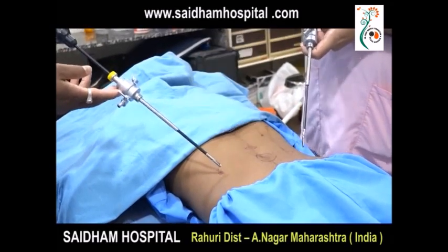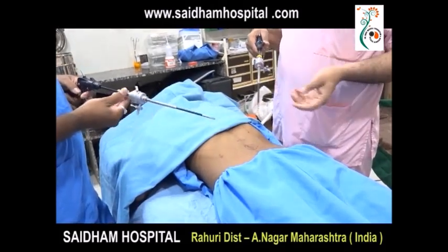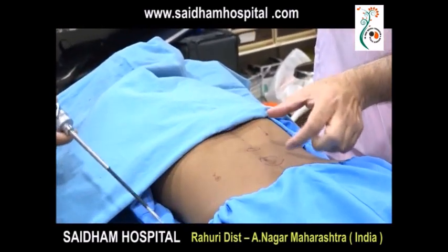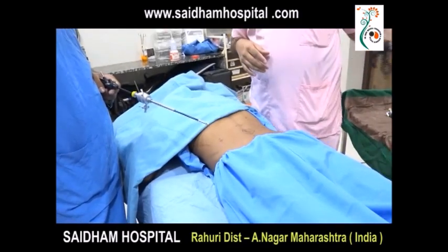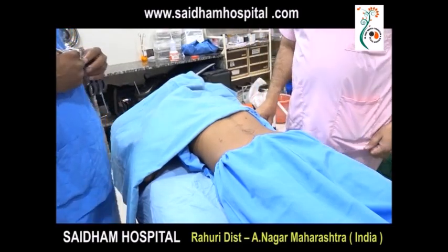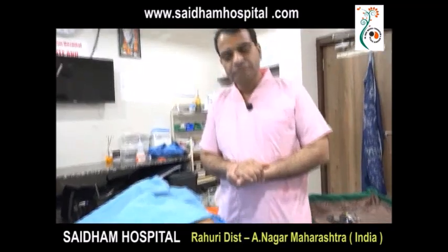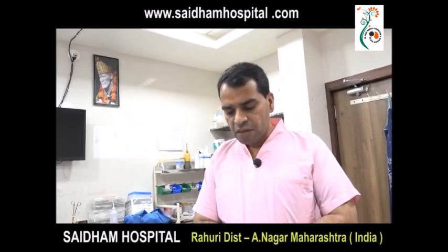The central position of the camera is very important for proper depth perception — it stays away from organs and avoids collision with instruments. Take-home message: the four-port technique is sufficient for all gynecologic endoscopic procedures. Follow the baseball concept for instrumentation. If port position is correct, half the surgery is done, because the ports act as the channel for all instruments. Thank you.